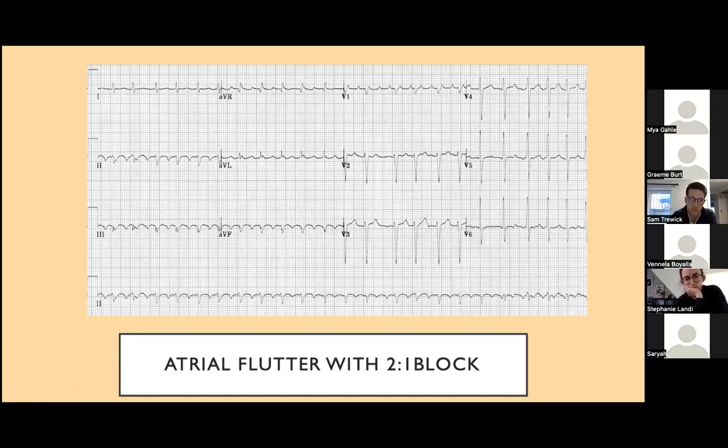Like I said, it's useful just to learn that diagram and get in the practice of looking for axis, because it has relevance in things like right heart strain, patterns like that, which again, if you don't look for, you won't see. Did I explain that?